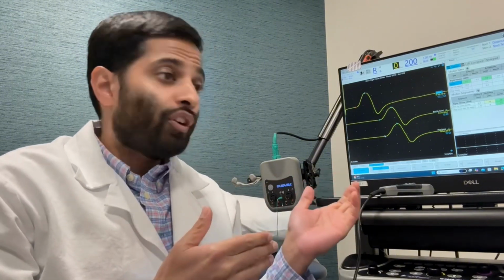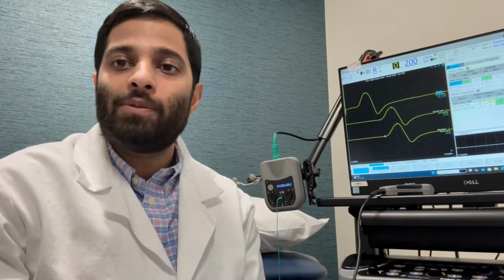Why can't I wear lotion before my test? That's a great question. So lotion can actually negatively impact our nerve conduction study. It actually affects the speed of the nerves. And so we recommend not wearing lotion on the day of a test. Similarly, cold weather or cold body temperature can actually falsely slow down the speed of the nerves. And so what we actually keep in the room is a blow dryer. So if the patient's limbs are too cold, we can warm up their arms or warm up their legs.